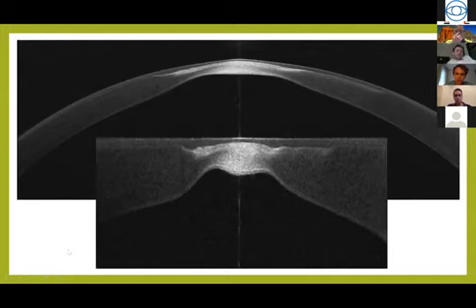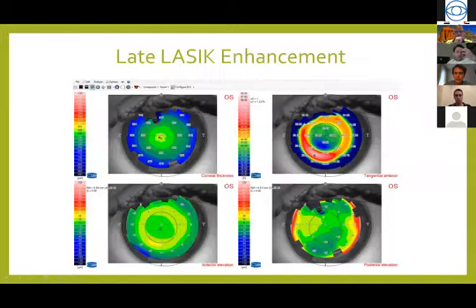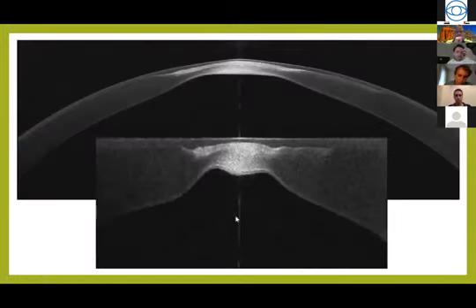This is basically high resolution OCT, and I could precisely see how the scar is not only full thickness, but also affecting the endothelium and Descemet's membrane. And then if I do a DALK in this case, it will be useless, because the underlying tissue will still be opaque. So if you have to do something, it will have to be a PK in this case, because well, you can always do a DALK and do a little perforation here, but this is a bit more tricky.